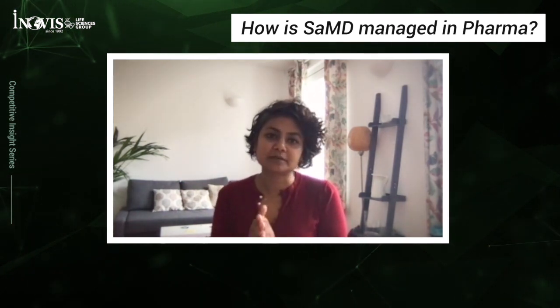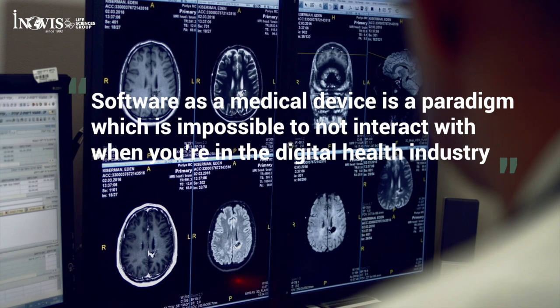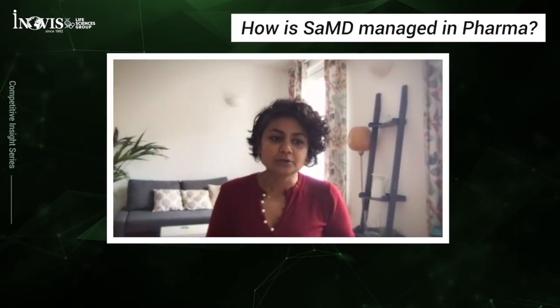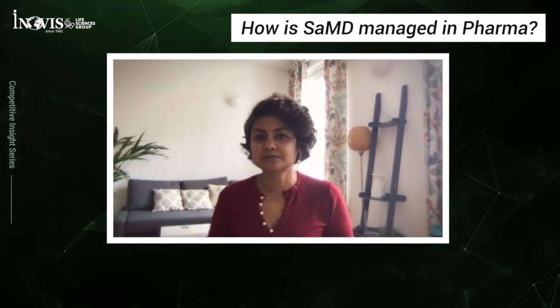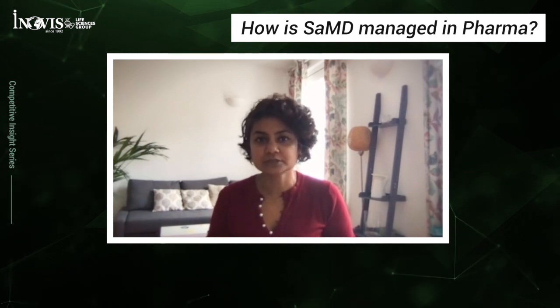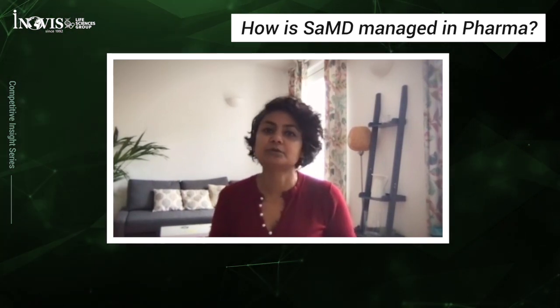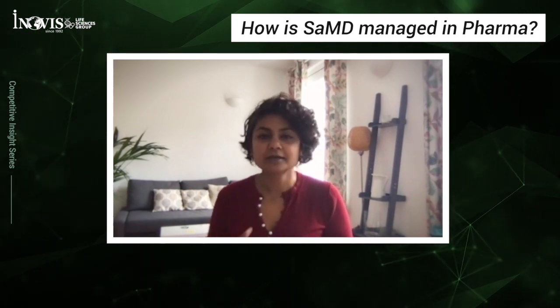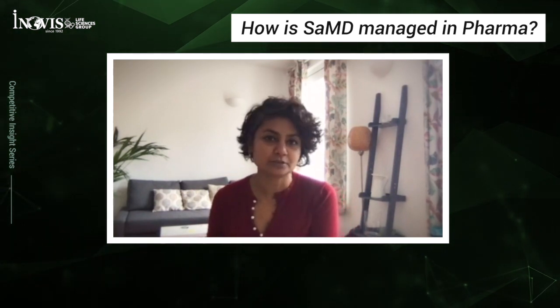But bringing it back to the SAMD side, software as a medical device is a paradigm which is impossible to not interact with when you're in the digital health industry and when you're based out of Europe. The new medical device regulations, which came in at the end of May, essentially reclassified all the digital applications, making digital applications which were not even class 1 before class 1, and those which were class 1 into class 2A or class 2B. So if you're building digital health applications targeting Europe and European users, EU and even UK, then SAMD is the daily bread and butter. Essentially you will have to familiarize yourself with the requirements.